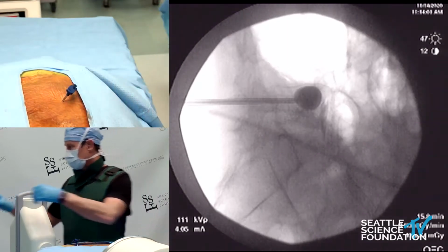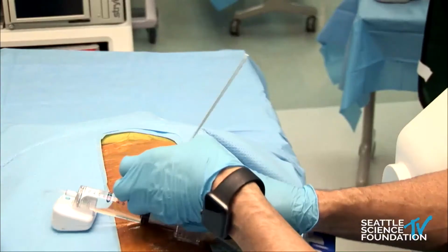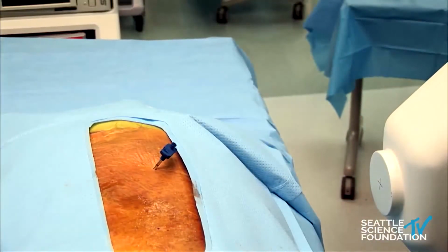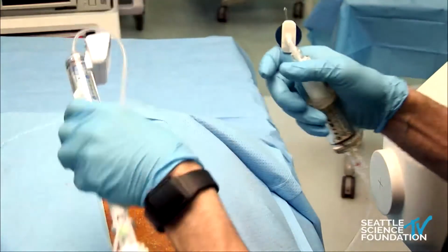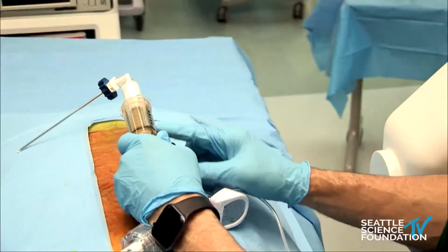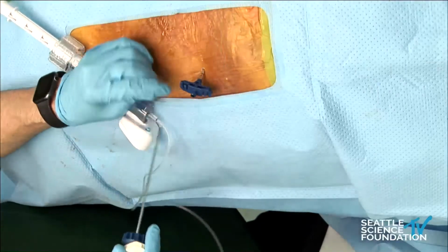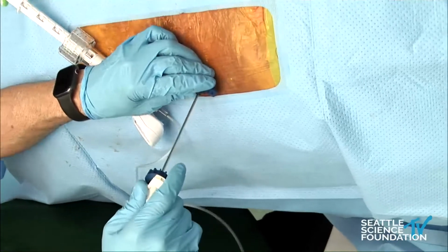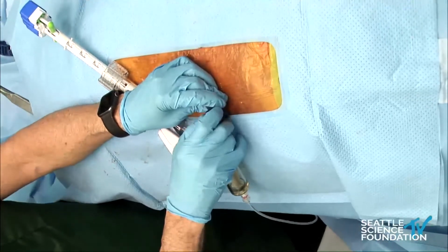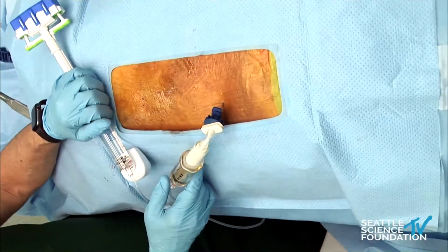Okay, so cement. The cement is put in hydraulically by water pressure, and this is the amount of cement that goes in, keeping track. This is a cartridge that holds it, and this will be placed along, and I will advance the internal stylet just a little bit, and this is a screw locking mechanism. It will lock onto it, so we'll take a look.